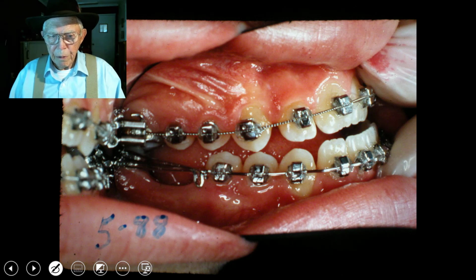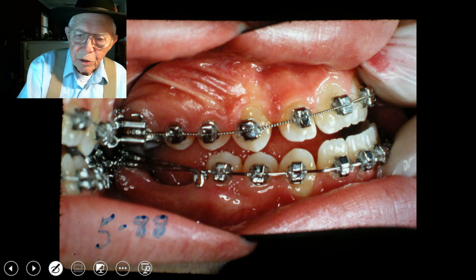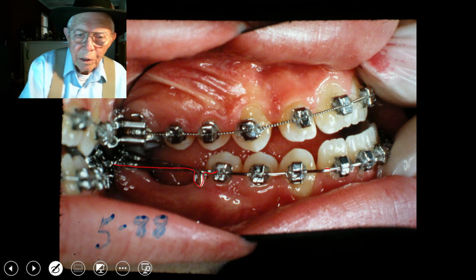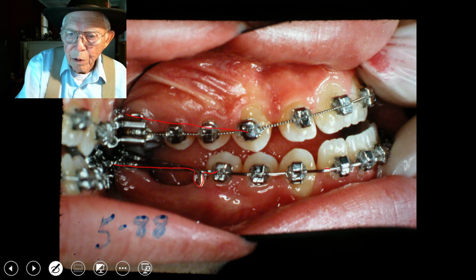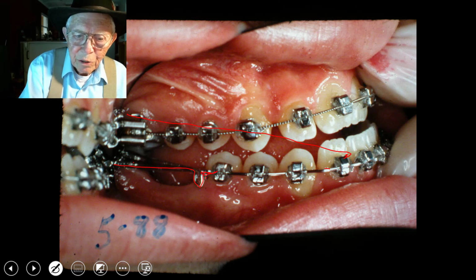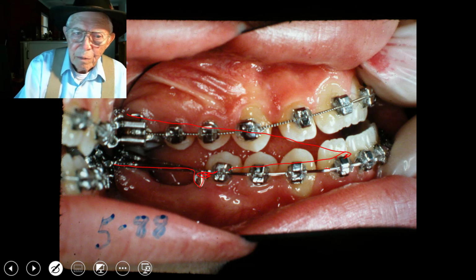Now here, excuse me, we've started off and we've got this lower jaw set up so that this is the omega right here, and it's going back in there, and we're going to close this up, you see, as it goes in there, and we'll be pulling forward with this in that direction, and we'll tie this arch wire back real tight here and pull this portion of it back in this direction.